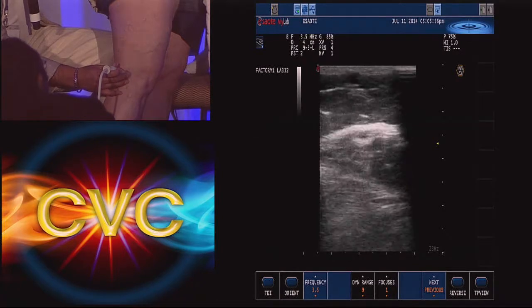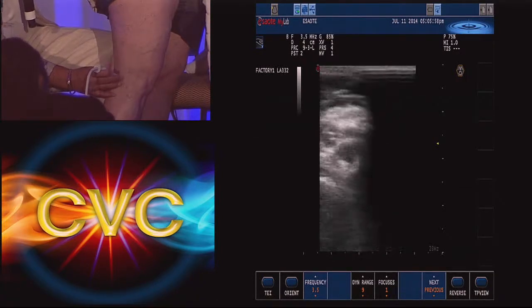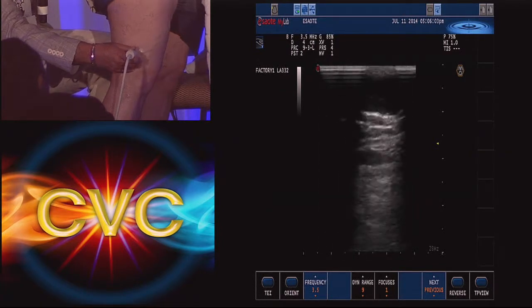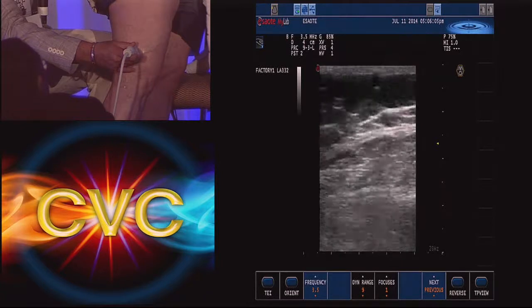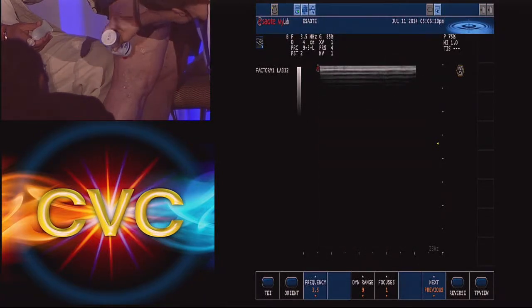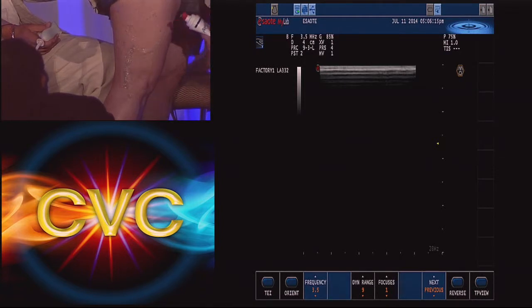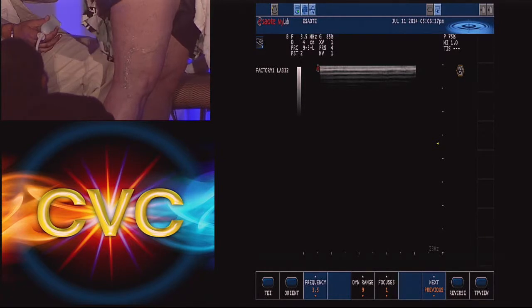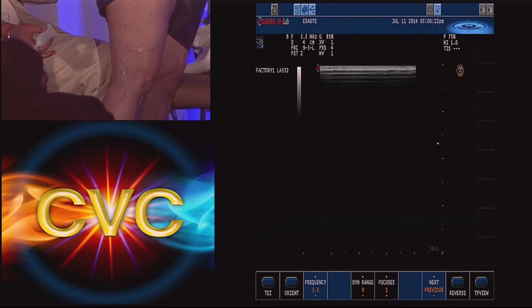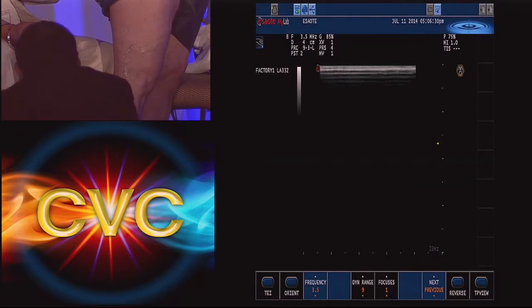If the GSV was not refluxing at the top, then you would not treat that portion, right? You'd only go up to the perforator. A little more gel, please, on this side. I don't think he heard your question. If the greater saphenous didn't demonstrate reflux, but you saw the incompetent perforator, I would do the perforator. So wherever there is incompetence and the pressure is coming from there, that's what you treat. Because the deep is higher than the superficial. Normally, your superficial should be zero when supine or when you're standing 20 to 30.